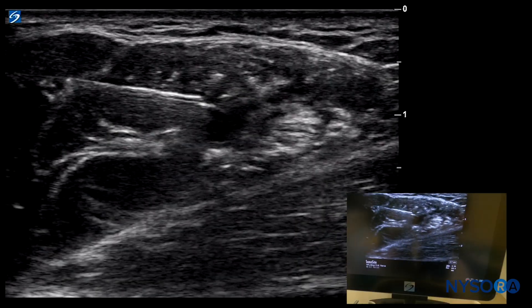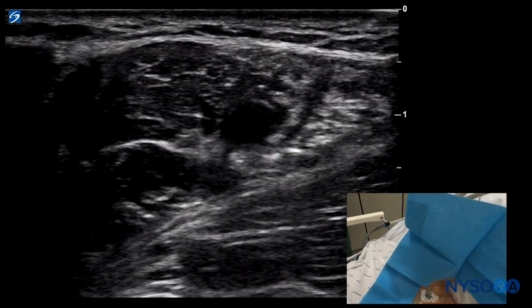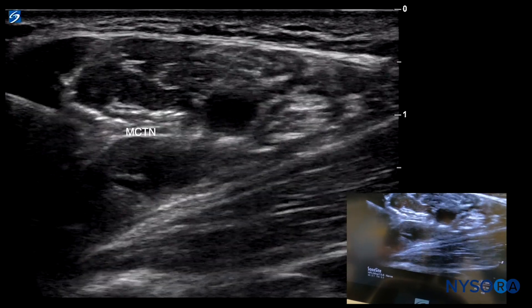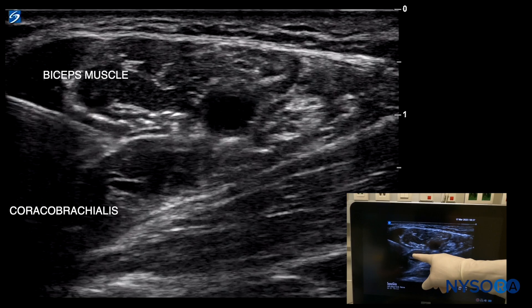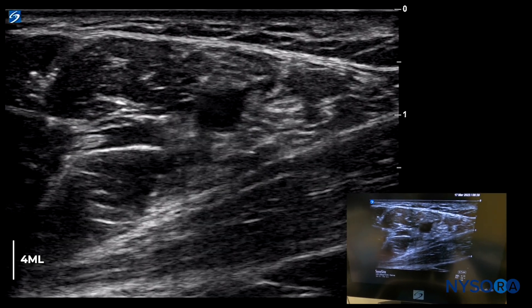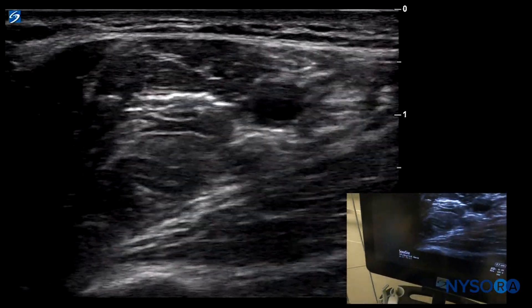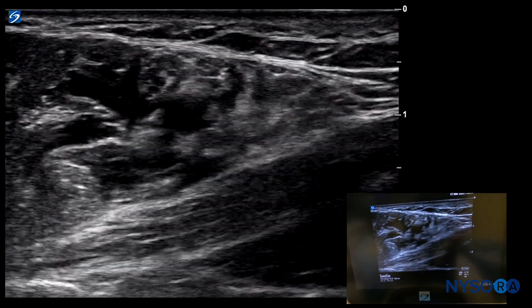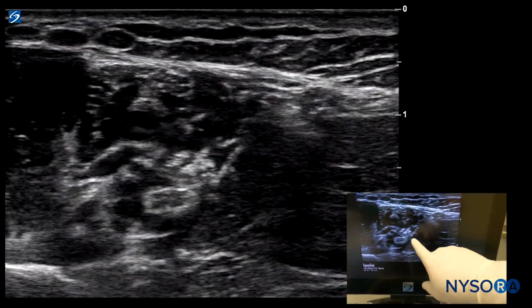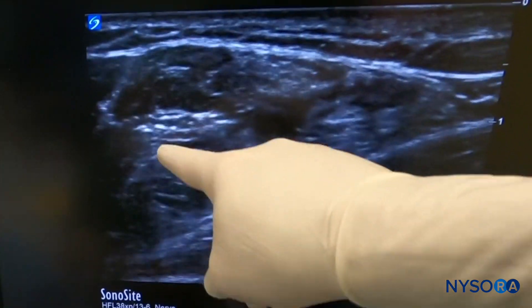We inject another eight milliliters. The only thing left to block is the musculocutaneous nerve. We go back into the biceps with a sharp angle redirection, almost out-of-plane, and steer the needle in the fascia or sheath between the biceps muscle and coracobrachialis. Pulling back slightly into that sheath gives us a nice injection for the musculocutaneous nerve. Examining afterward, we can clearly see local anesthetic around the ulnar nerve, median nerve, and radial nerve — the whole sheath is filled.